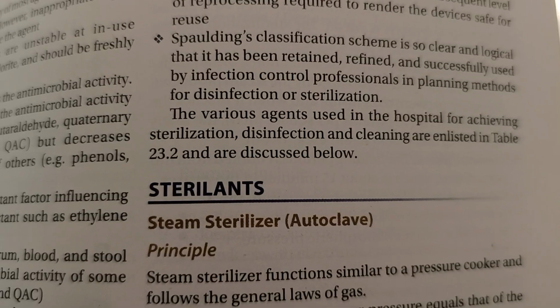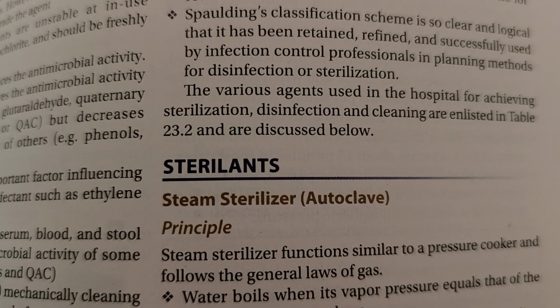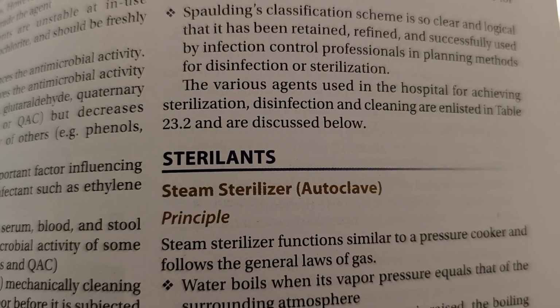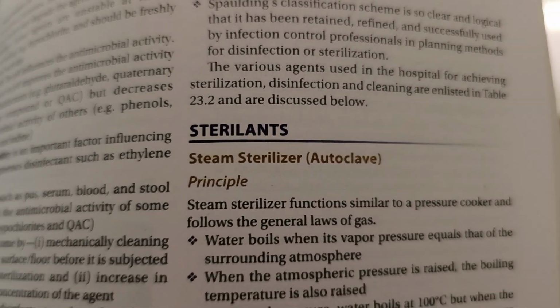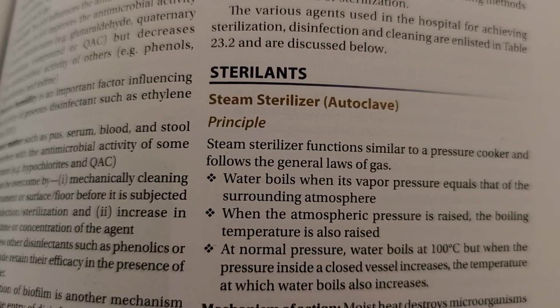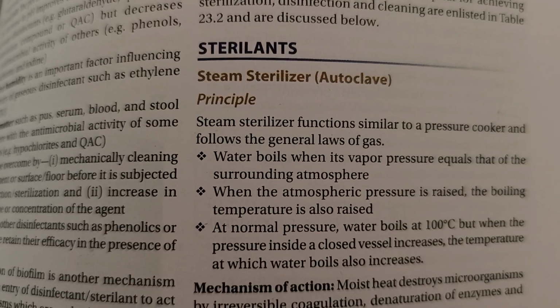Spaulding's classification scheme is so clear and logical that it has been retained, refined, and successfully used by infection control professionals in planning methods for disinfection or sterilization. Various agents used in hospitals for achieving sterilization, disinfection and cleaning are enlisted in Table 23.2 and are discussed below.